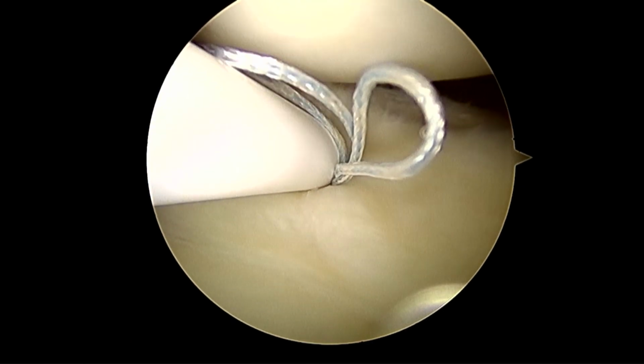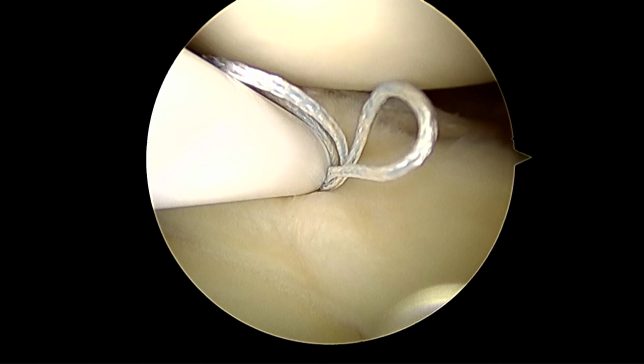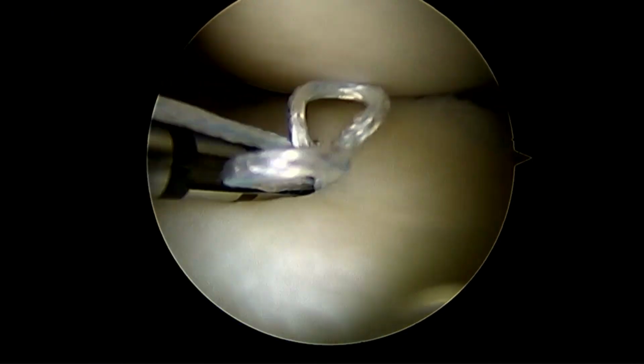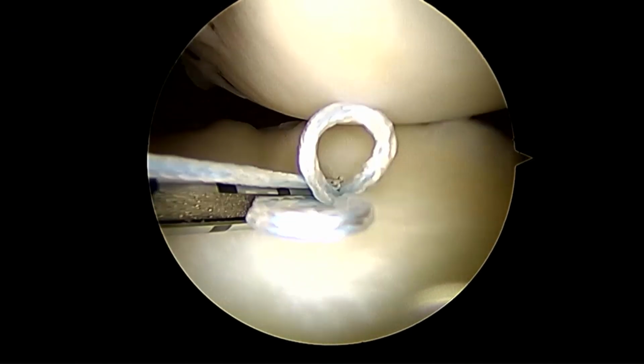This is after the trepanation and preparation of the peripheral part. This is the cannula. This is the depth. This cannula will avoid too much penetration there. The needle is going from the substance of the meniscus towards the periphery.